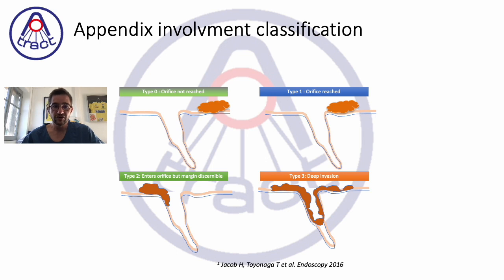When the orifice is reached and when it enters, it becomes more difficult, but still in the series from Toyonaga it is still possible to do ESD with underwater strategy, for example, to cut the margin into the appendix.